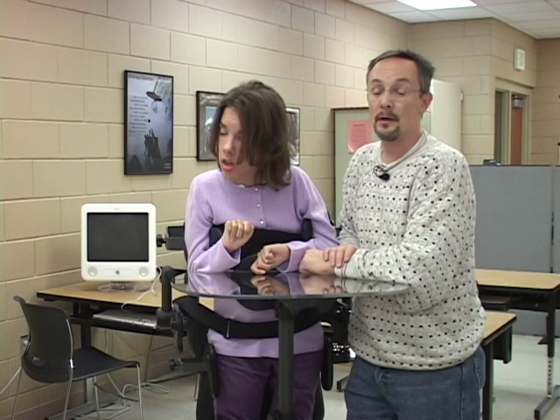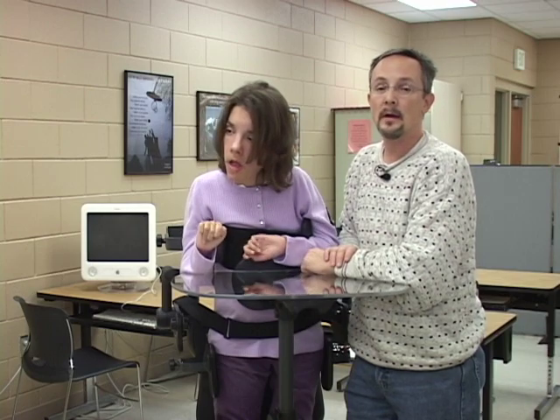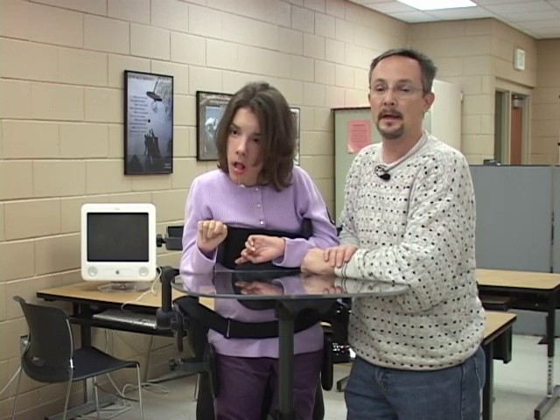The other thing that's really helpful for her is that she likes to change her position. If you're in a chair all day long, it gets old and she gets tired of that, so she actually asks to be in her stander. So I think that by being in her stander, it helps her not only change her body, but sort of her frame of mind of how she's feeling about her day.